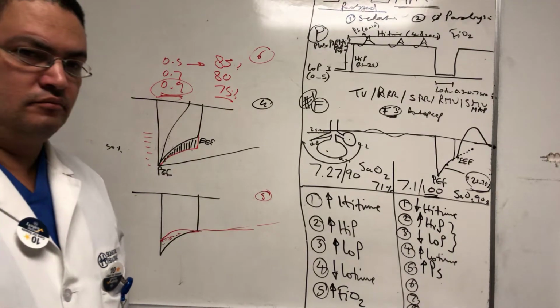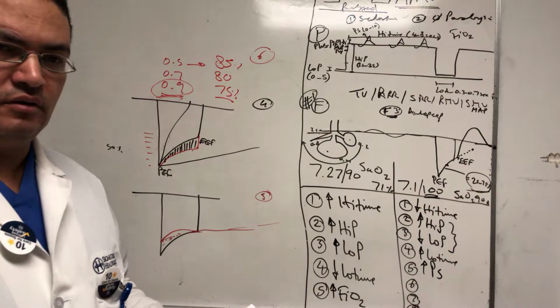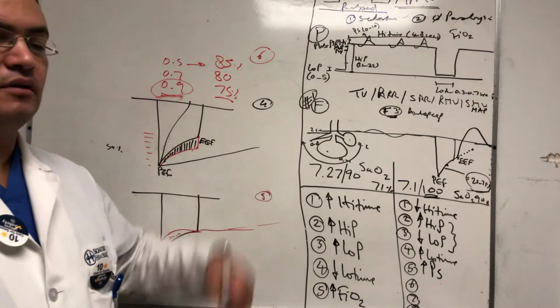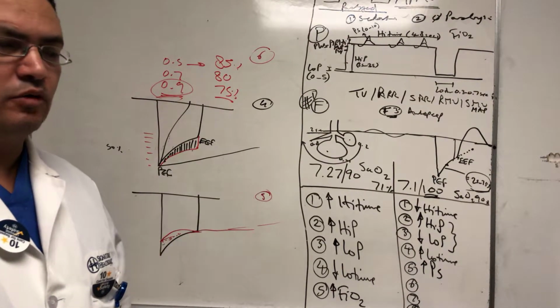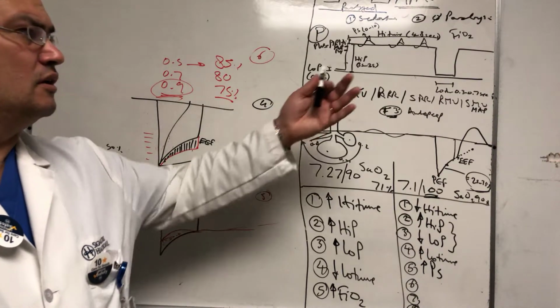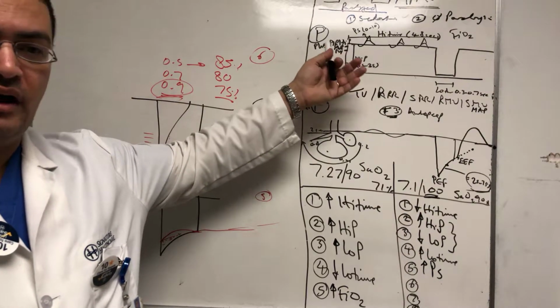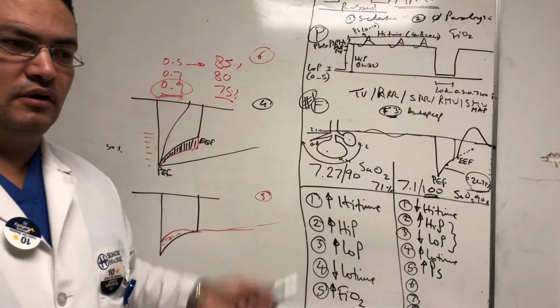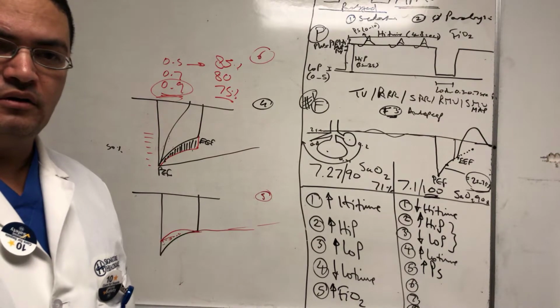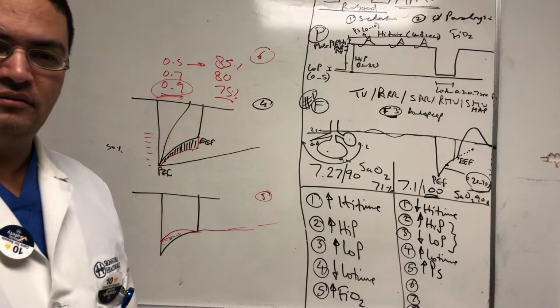Yeah. But both the APRV and bilevel have pressure support in them because of the small breaths, right? So you increase basically your spontaneous minute ventilation. It goes, let's say, from 100 to 150 each breath, and that will count. You don't add up, and you have more minute ventilation that way, right? But why is it number 5?